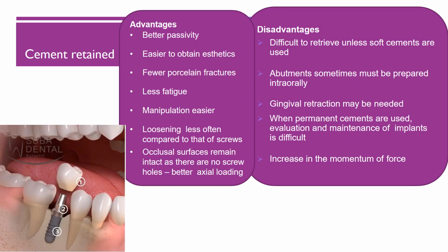So coming to the differences between cement retained, there are advantages and disadvantages we are going to deal with. What are the advantages? There is better passivity, easier to obtain aesthetics, fewer porcelain fractures, less fatigue, easier manipulation, and loosening less often compared to that of screws. Occlusal surfaces remain intact as there are no screw holes, so better axial loading.